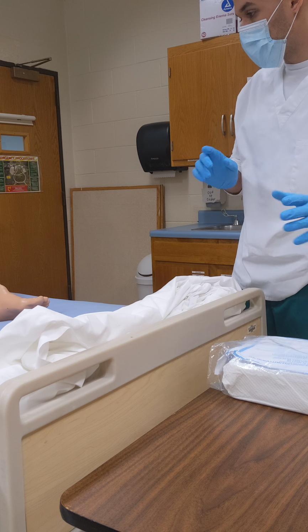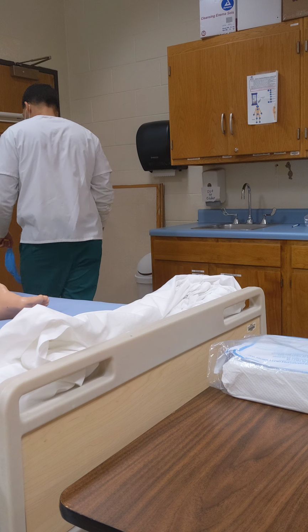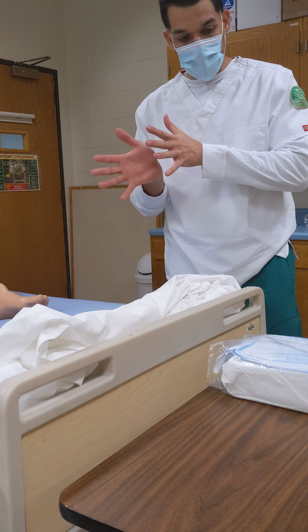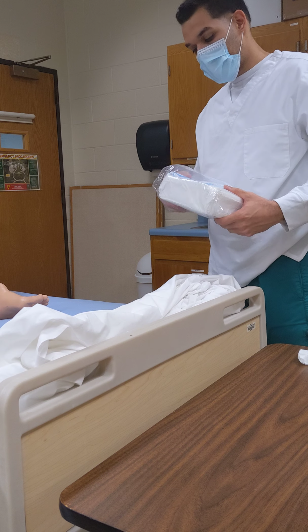Sorry, before I do that, I want to remove my gloves and do hand hygiene. There's no other gloves around, but I would put a new pair of gloves on just to keep it as clean as possible. Take out the kit.